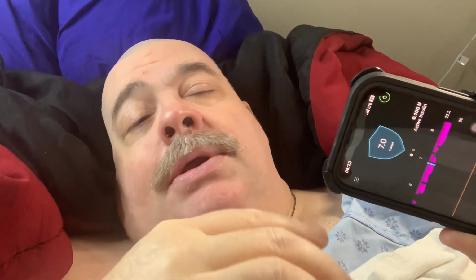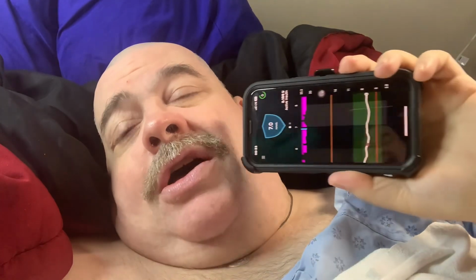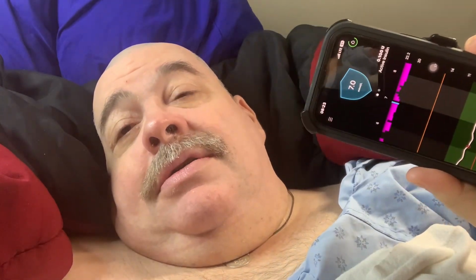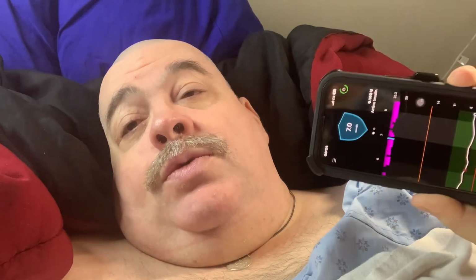The pump will not allow them to go longer than 7 days, on the Medtronic one. Dexcom, I believe, is 10. It's not a lifelong thing. You have to carry an extra sensor. You may have to touch your phone to it all the time if you're dealing with Freestyle or that, or touch a receiver to your sensors.